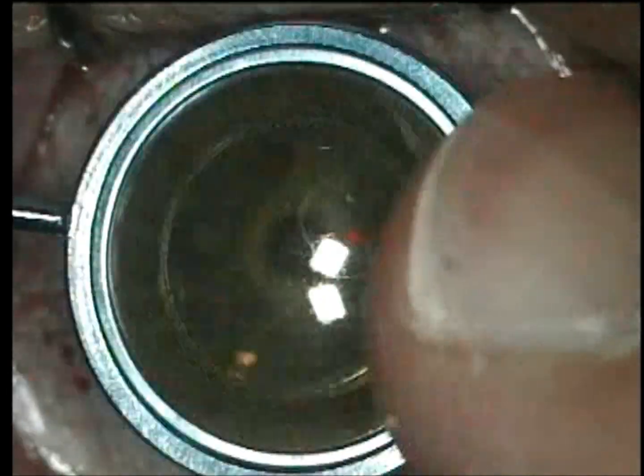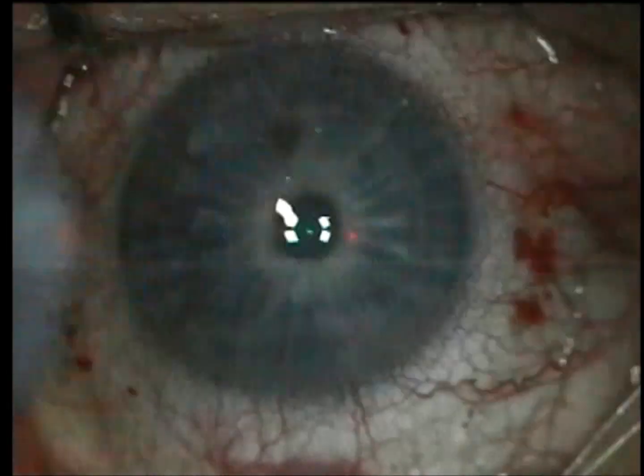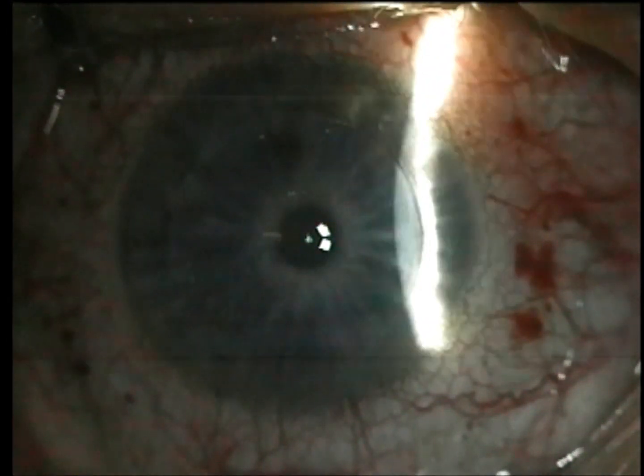Then I sweep with a moist sponge and look with the slit lamp of the Allegretto laser. I'm going to use a Rhein Johnson flap applicator to flatten out. And then pretty much I'm done — beautiful procedure.